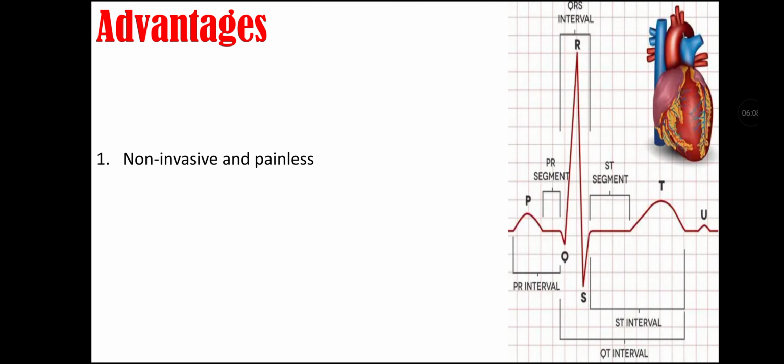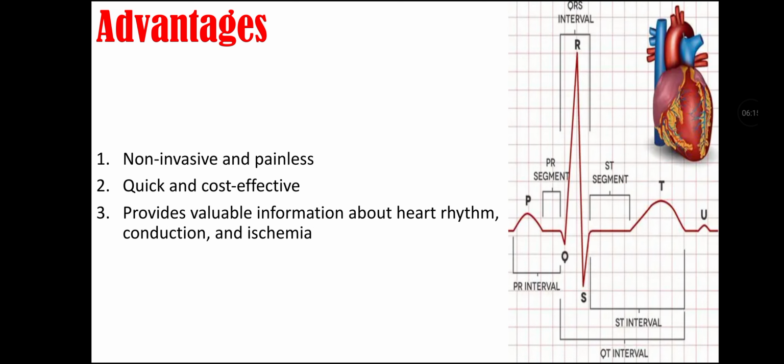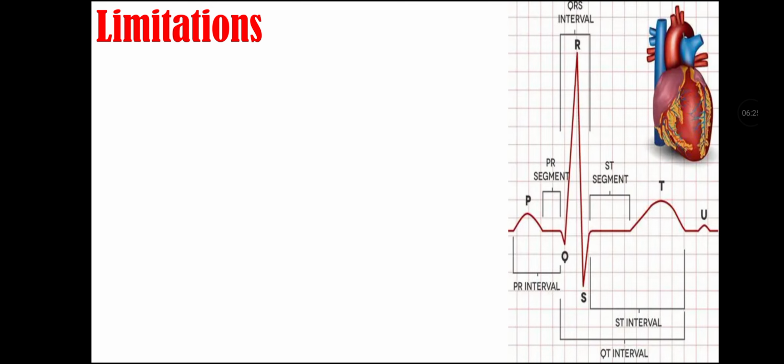Advantages of ECG. First, it is a non-invasive and painless procedure. Second, it is a quick and cost-effective procedure. Third, it provides valuable information about heart rhythm, conduction, and ischemia. Fourth, it is useful for diagnosis, monitoring, and prognosis.